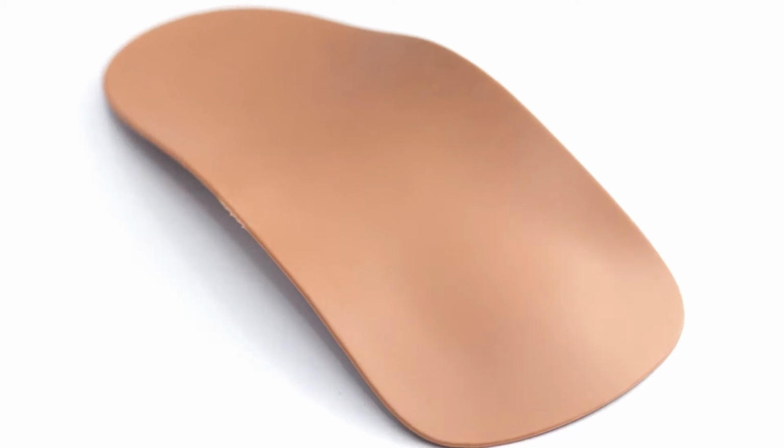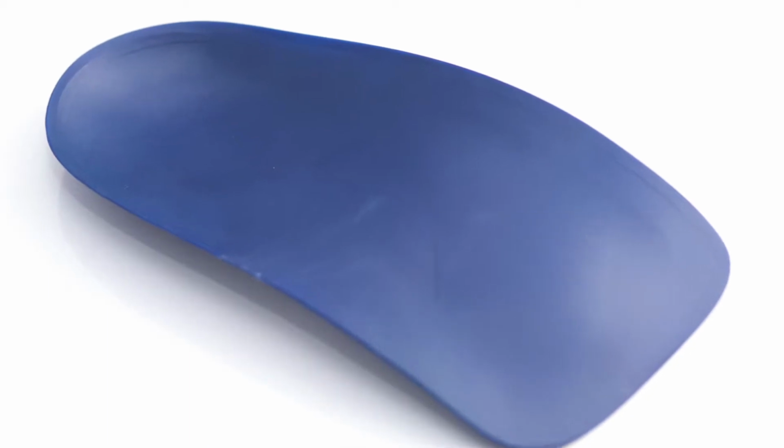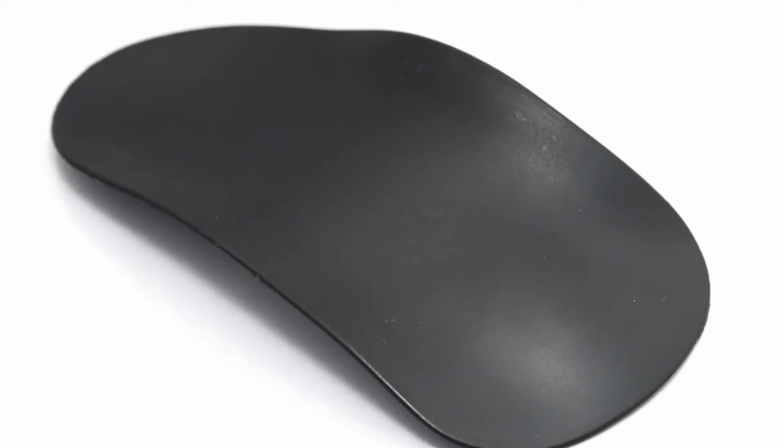Accommodative orthotics are a little bit different type of an orthotic. These types of orthotics are generally used to minimize or limit pressure in certain areas on the bottom surface of the foot. These orthotics come in a multitude of layers and styles as well. And the last one we're going to focus on today are the prefabricated orthotics. Now, many different manufacturers are developing prefabricated orthotics, and they come in a wide array of shapes, sizes, colors, and materials. The most important factor usually is the material and the style of these prefabricated orthotics.